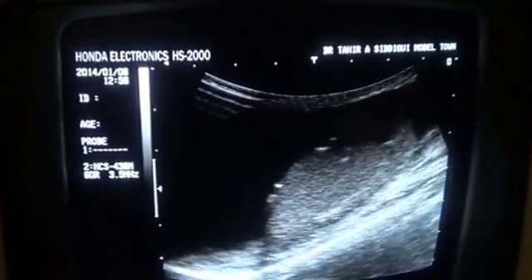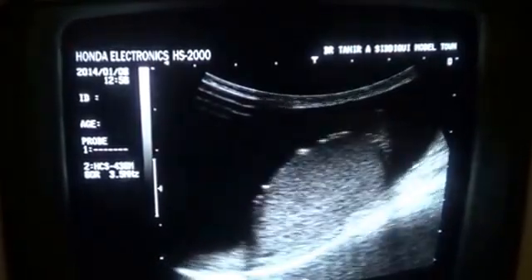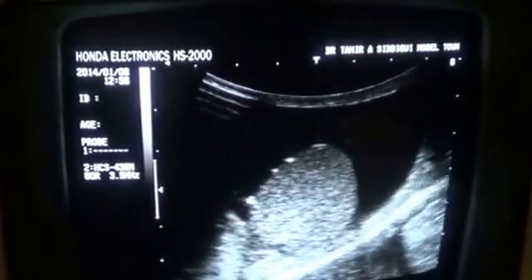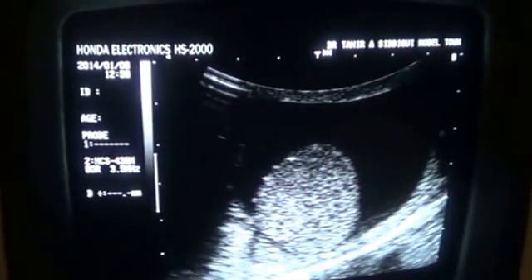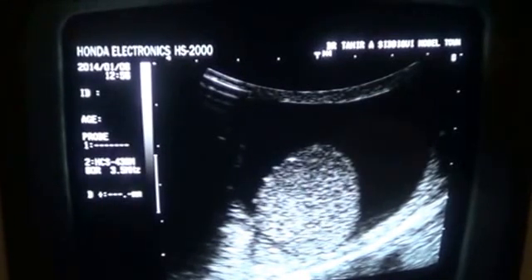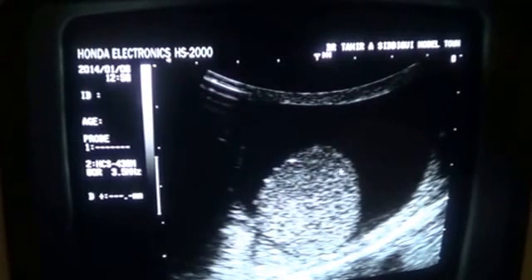In the transverse section of the right testis, surrounded by fluid all over, these are the echogenicities. The echogenicity of the testis is showing coarseness with tiny hypoechoic areas scattered within the parenchyma of the testis.